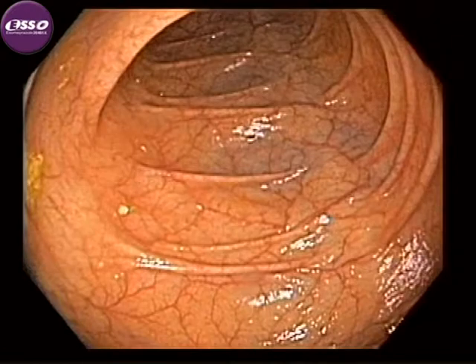The standard of medical care requires that a colonoscopist who sends a patient for surgical resection of a lesion accurately locate that lesion for the operating surgeon. Remember to never get cocky about where you think a lesion is located. If it's not in the cecum or in the right colon near the ileocecal valve, tattoo it. In the rectum and sigmoid, even though you may be confident that you know the section of bowel that the lesion is in, it's still often best to tattoo the lesion to make it very clear to the surgeon. Tattooing the distal end of a rectal lesion can help the surgeon to understand how distal their dissection must be carried.